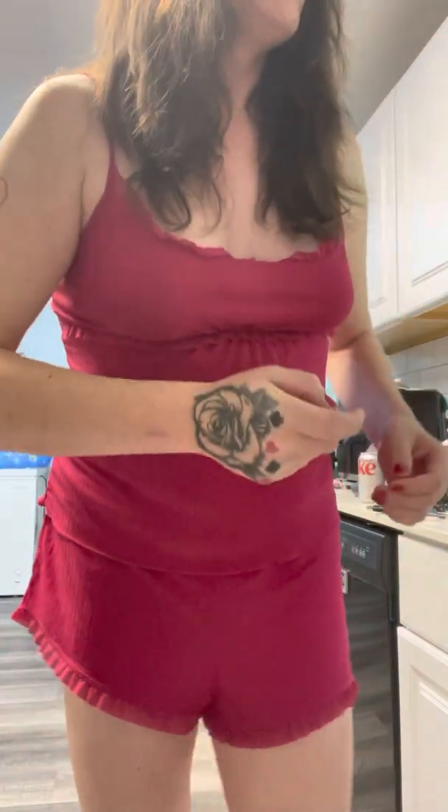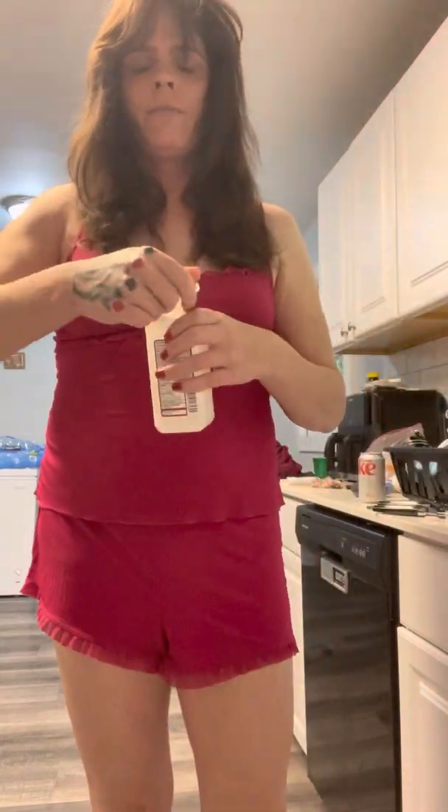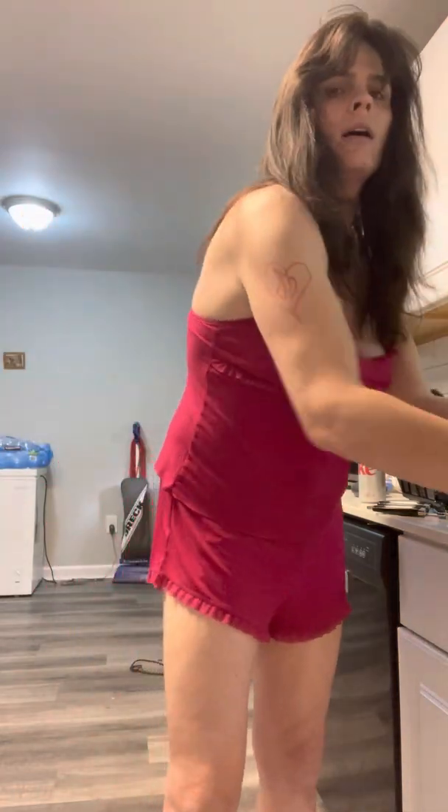One of the most important things I do for myself when giving myself an injection is cleaning your hands. Wash your hands with hot soap and water before giving yourself an injection. I even go as far as to put some alcohol on my hands — you can never be too safe.